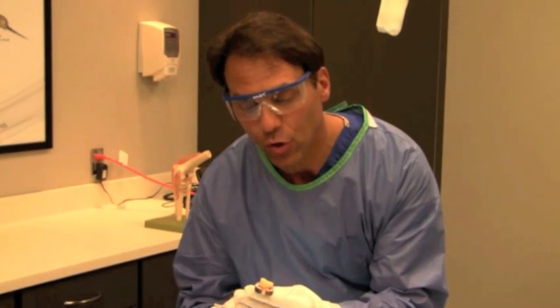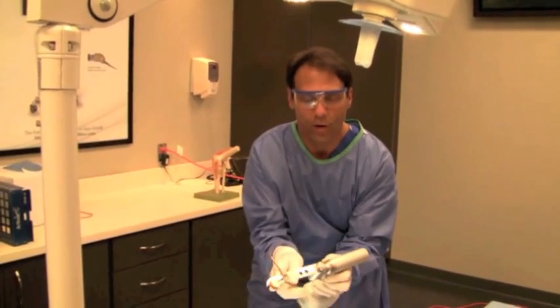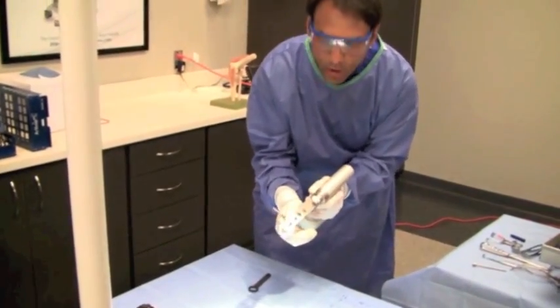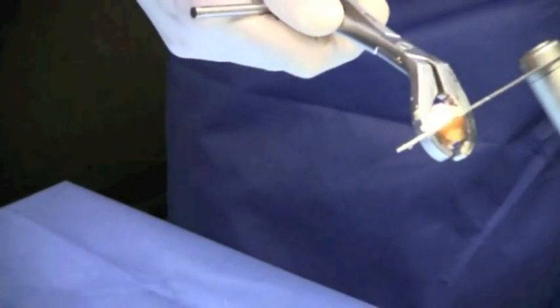So now what we're going to do is I've marked the graft so that all the way around we've got all the 4 quadrants, measuring north right here, all the 4 quadrants exactly like I wanted to, so we can make a nice level cut. Of course, in orthopedics, you measure twice and cut once. That's what we like to do. It's pretty flat there. Sort of test to make sure it's nice and flat this way.